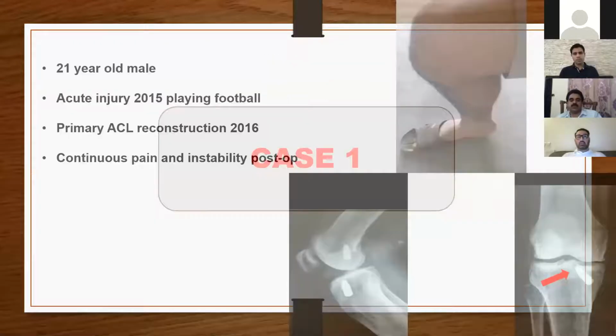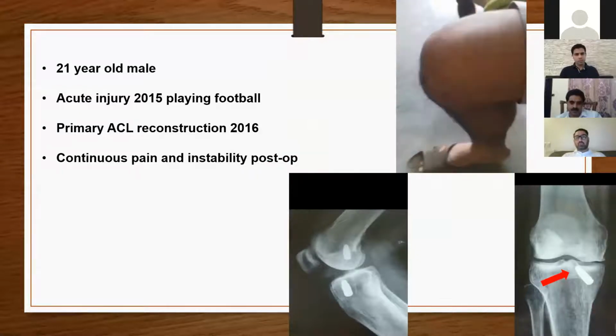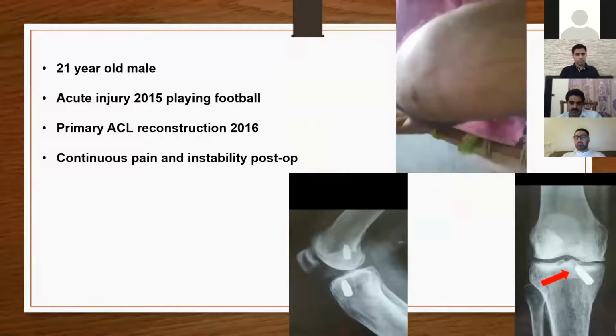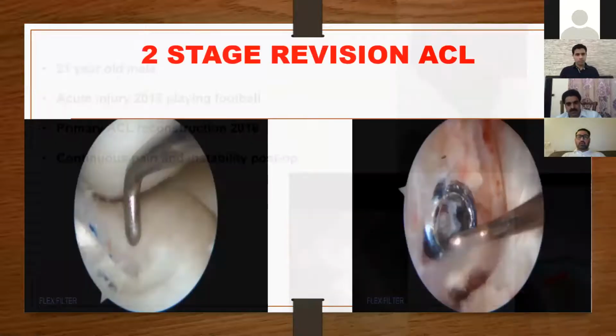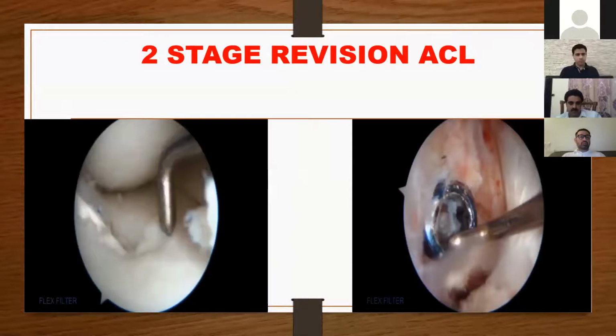Let's look at case one, a 21-year-old male, acute injury. He's a policeman playing football, primary ACL reconstruction done in 2016. These were one of the few early revision cases I've done when I started working in Pakistan. Continuous pain and instability. You can see that the graft and the tibial screw are not in the right place. When I looked at the arthroscopic examination, it's coming out almost from the tibial articular surface next to the meniscus.